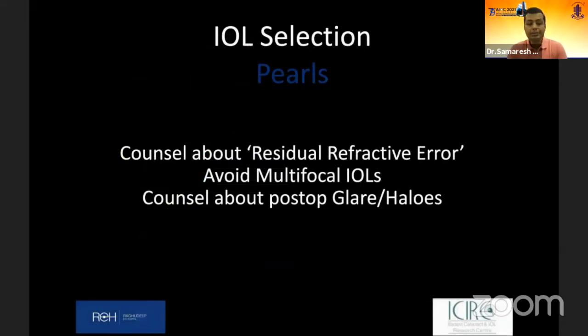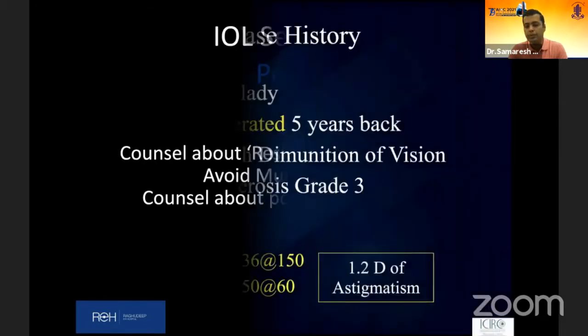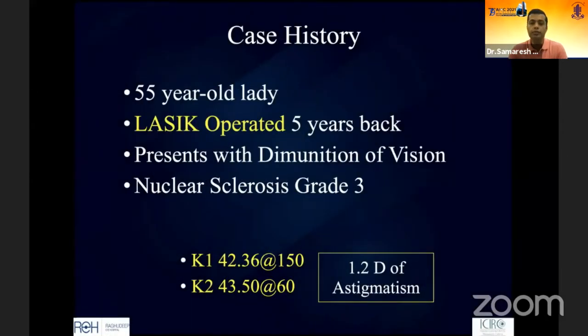I would counsel all these patients about refractive residual errors, despite the best biometries and calculations. And most definitely, in most patients, barring a few, I would avoid multifocal IOL and obviously counsel them for visual problems.